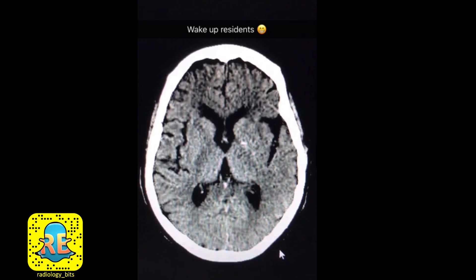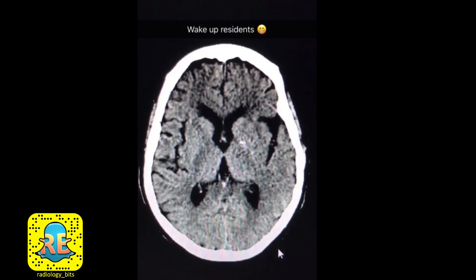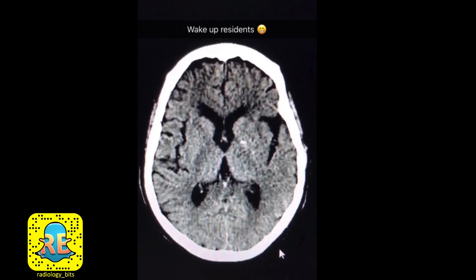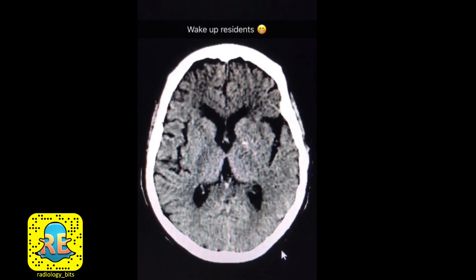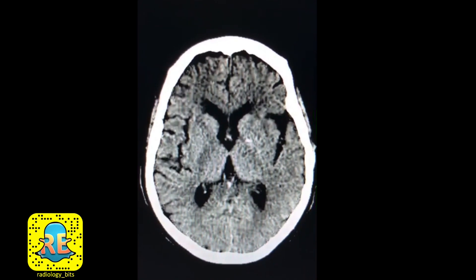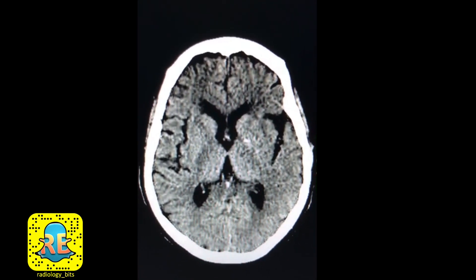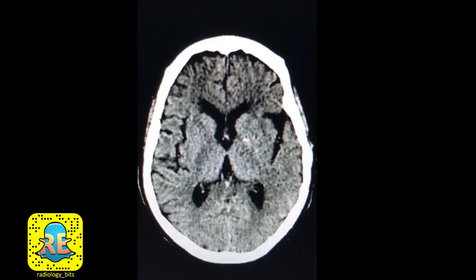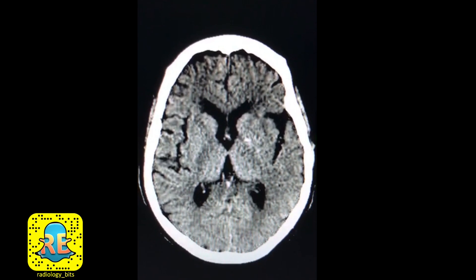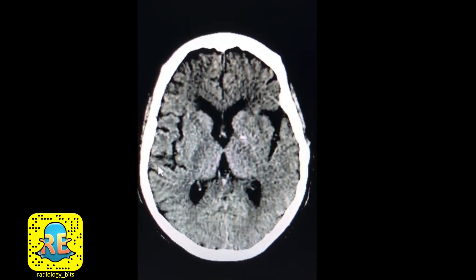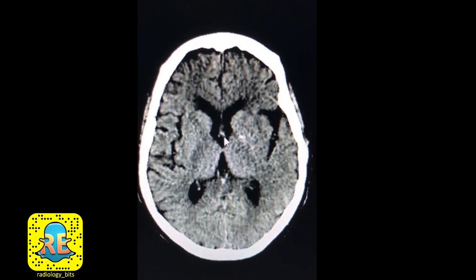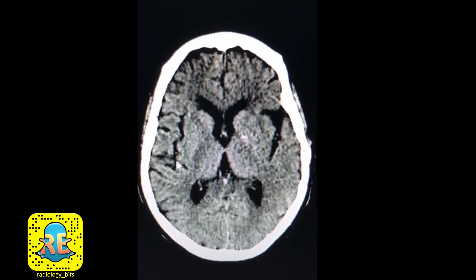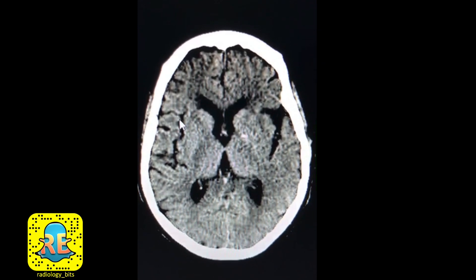Now that students and interns are oriented, let's go to the part most interesting to residents, in particular junior residents doing on-calls. This is an elderly patient, about 70. As you see older brains, you're going to have more CSF spaces — the volume of the brain decreases, and you'll have a more pronounced appearance of the ventricles and a more pronounced appearance of the sulci.